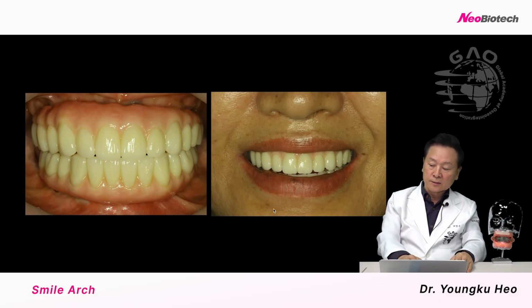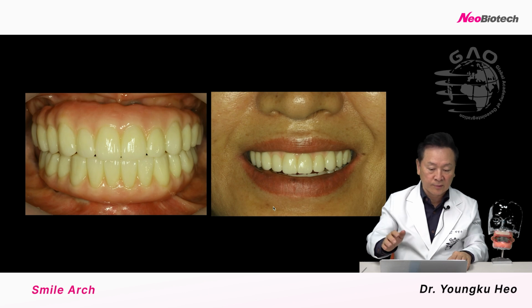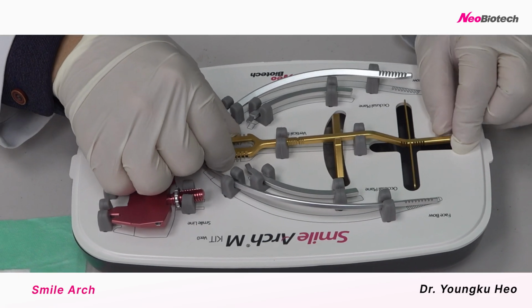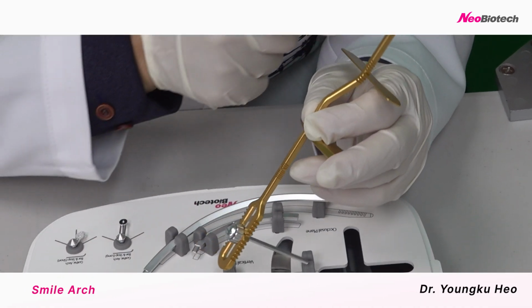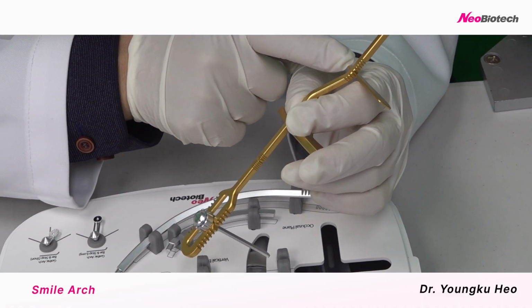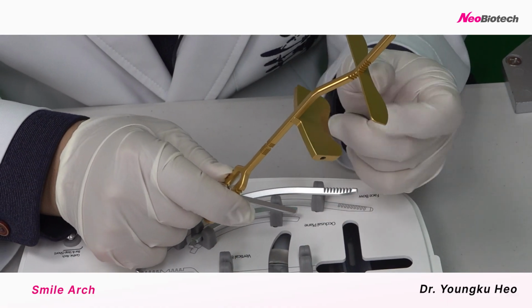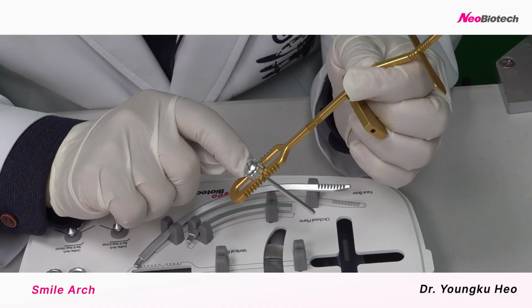So now I'd like to just show a little bit of hands-on. I want to show this to let you understand easily what the SmileArch is. This is a vertical bar. We can call this beam bar also. There are B, C, D points. This is the pupillary line. This is the subnasal site. This is the incisal edge. This is the vertical dimension.